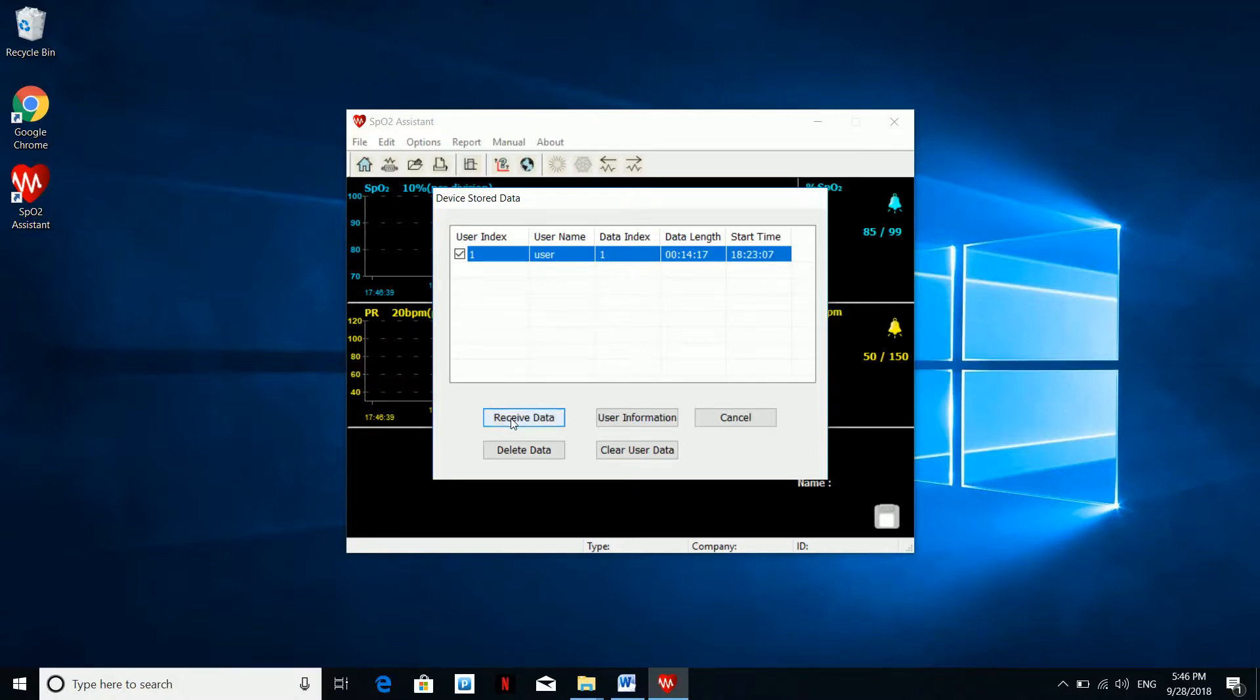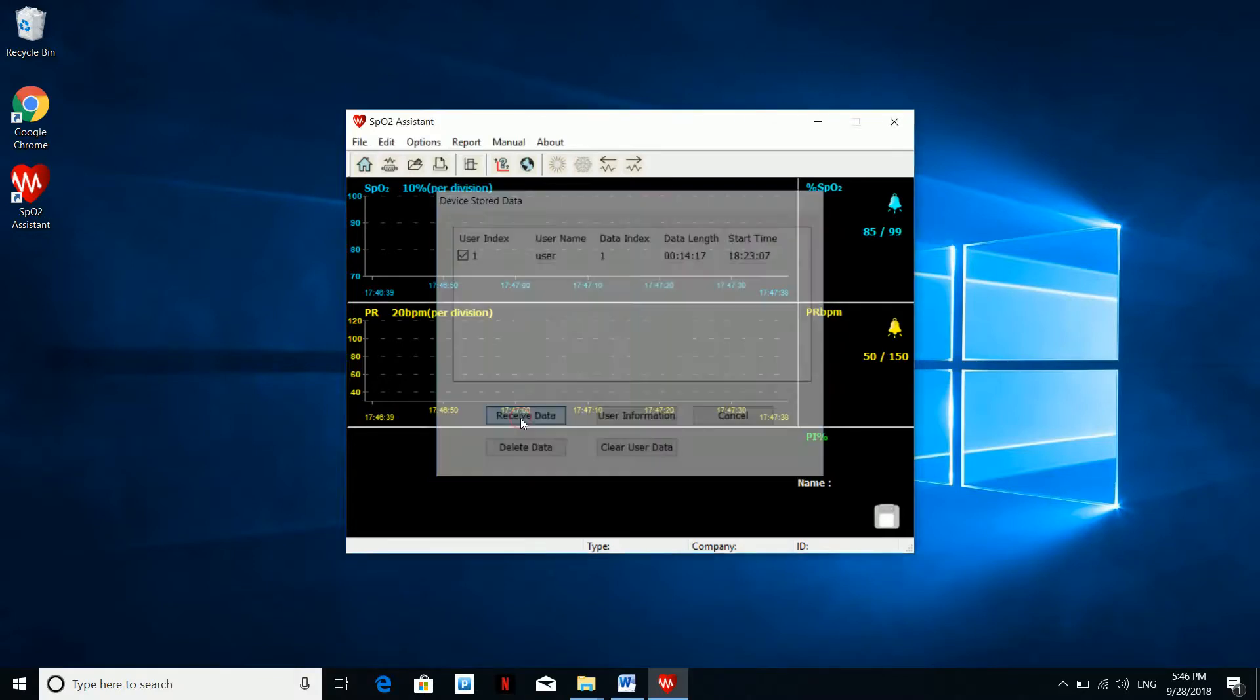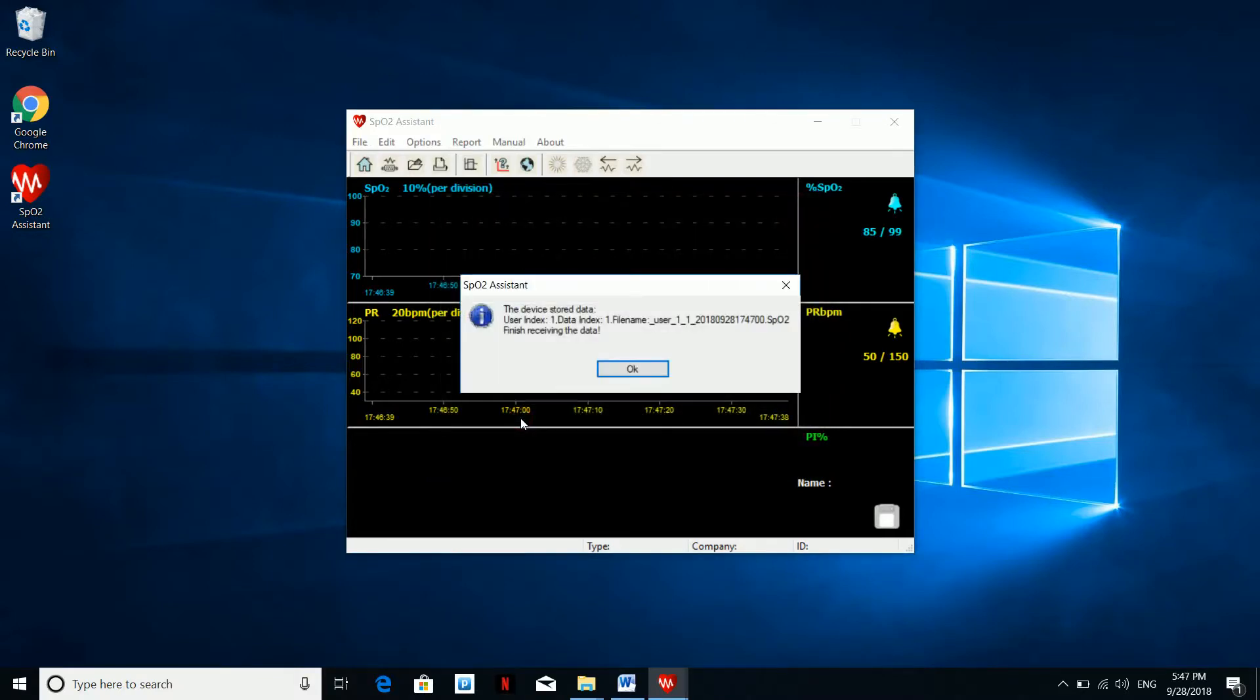Hit receive data. You will see a quick upload process and prompt saying that the data has been stored on your PC.